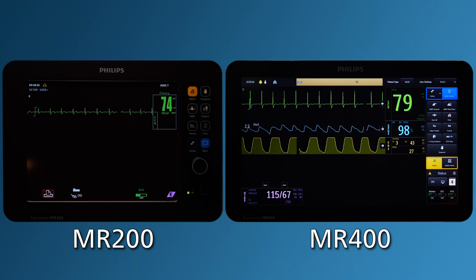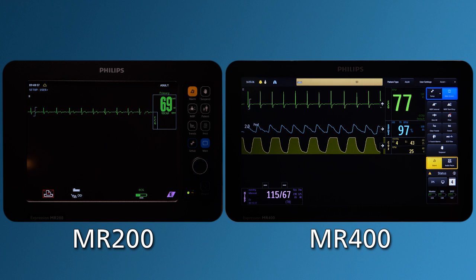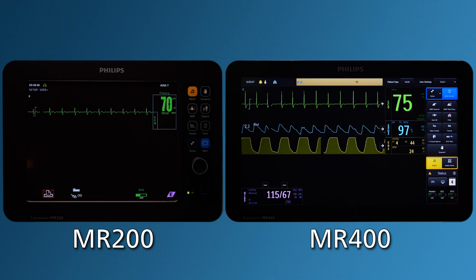For the MR200, the QRS complex should be approximately 2 millivolts on the display. That means the signal should be twice the size of the scale indicator, a 1 millivolt reference at any given scale setting. If it is not, then you will most likely get artifact during the MR scan.